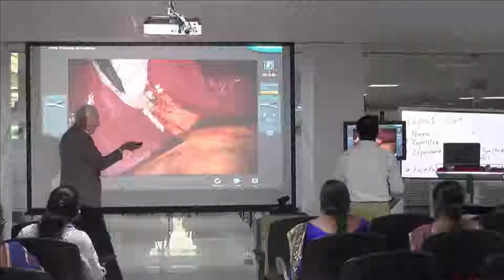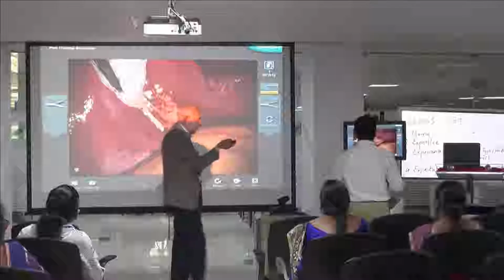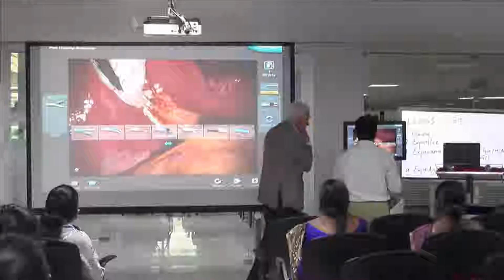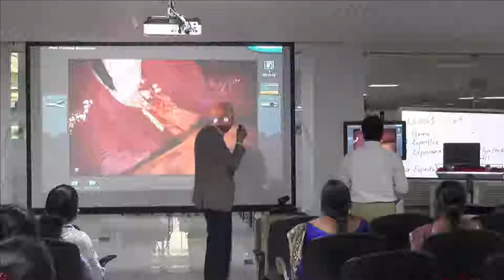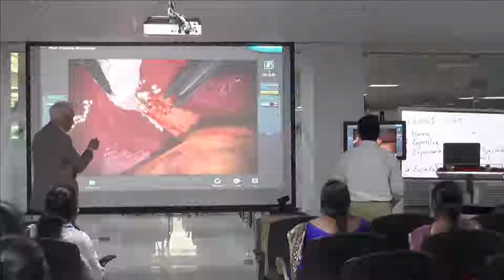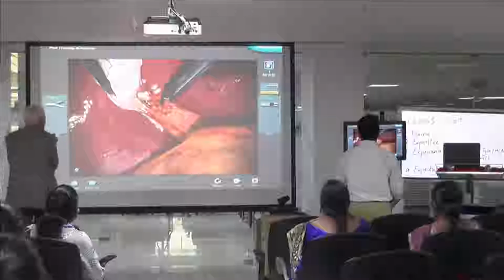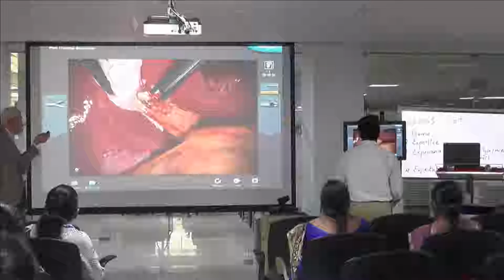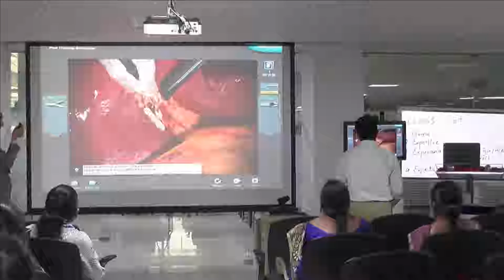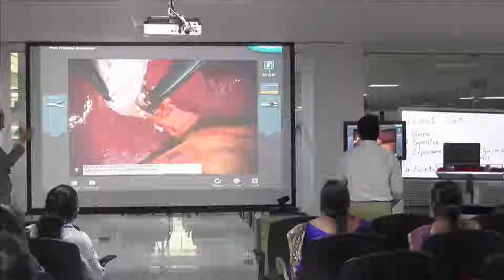So we have here no possibility to ligate, so we choose a clipping device. That's another instrument that the OR nurse had already prepared and is on the table. So that is the multi-fire clipping device, and then is taken care of the artery.